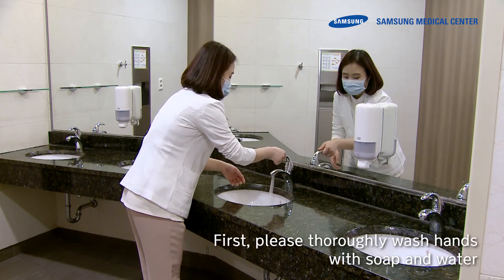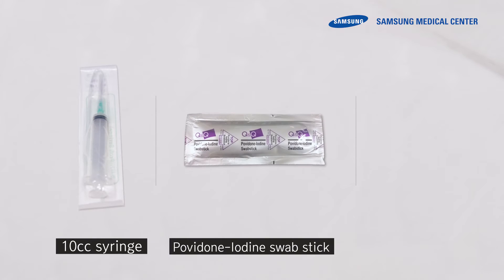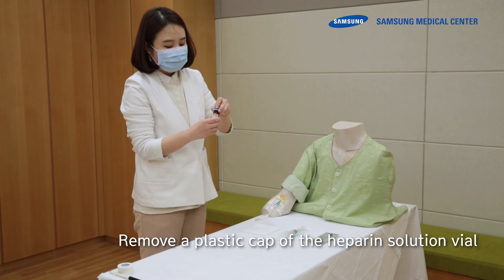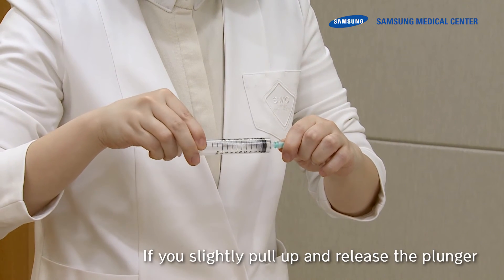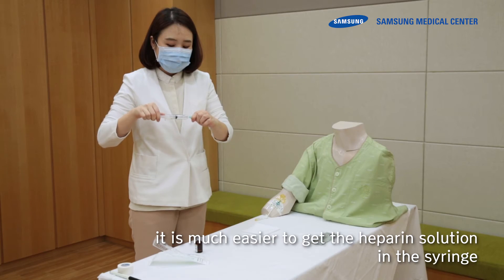First, thoroughly wash hands with soap and water. Have a syringe, sterile swabs, and a heparin solution vial on a clean towel. Remove the plastic cap of the heparin solution vial by pulling it up. If you slightly pull up and release the plunger, it is much easier to draw the heparin solution into the syringe.